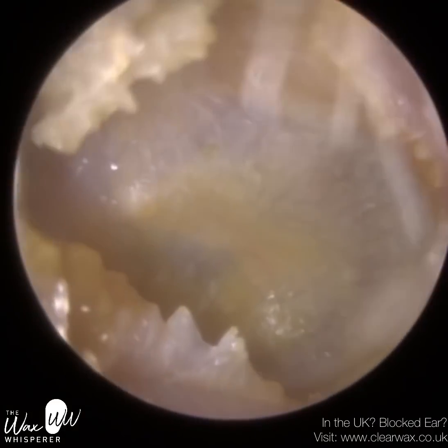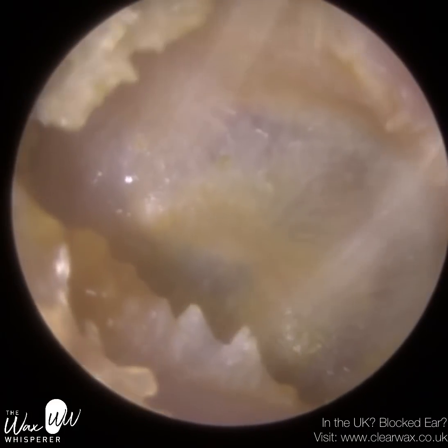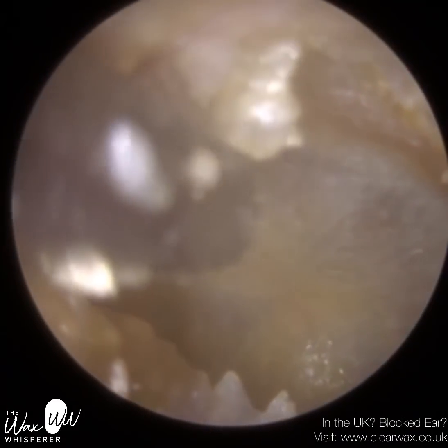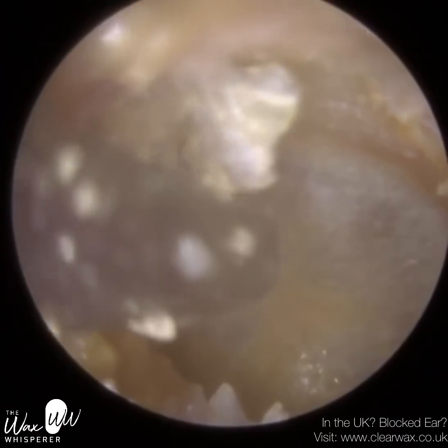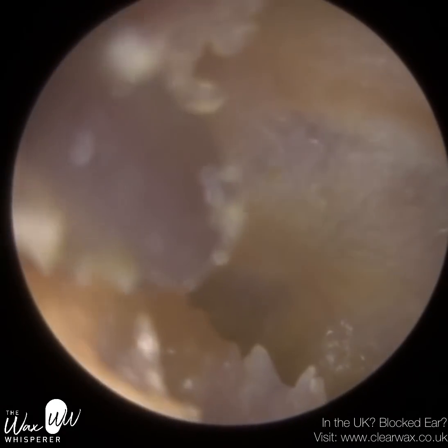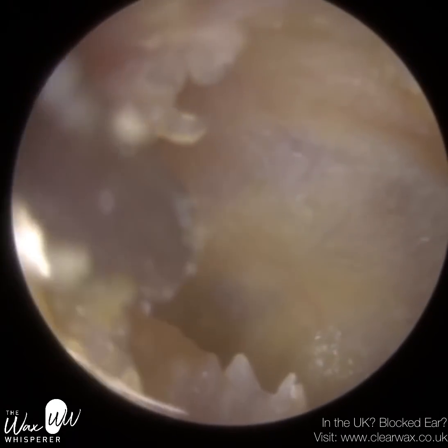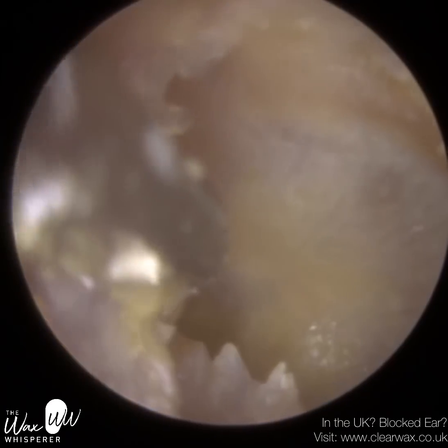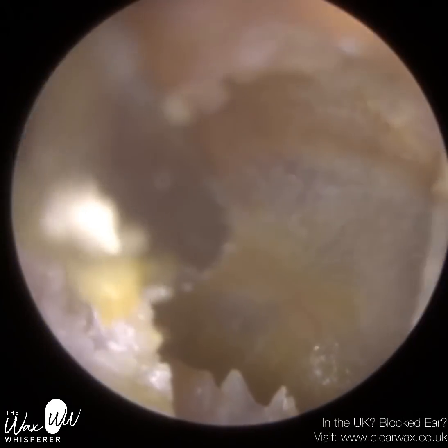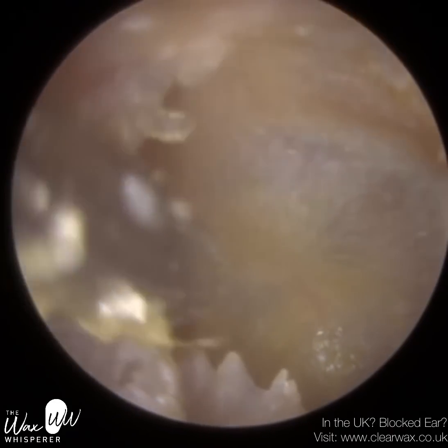And the patient is aware that they need to attend regularly to have their ears cleaned, to keep on top of it. So I'm just trying to remove as much as I can. But it is difficult because of the narrowness of the ear. When you've got a narrow ear like this, it's hard, number one, to get the instrument in, but then manipulating the instrument in the ear so you can pull the skin here, there, right and left, it's quite tricky.